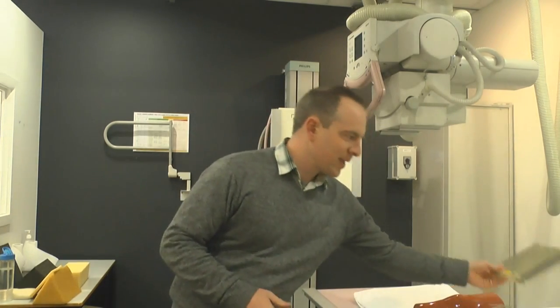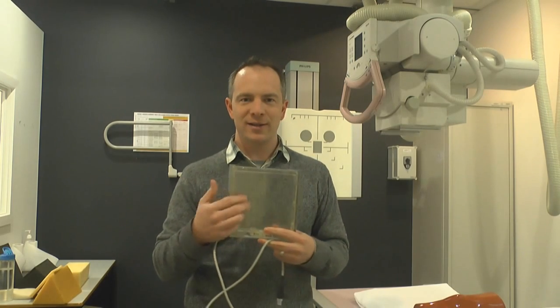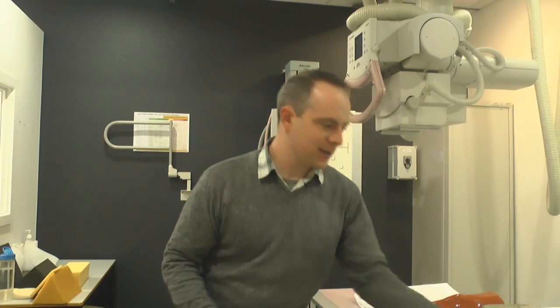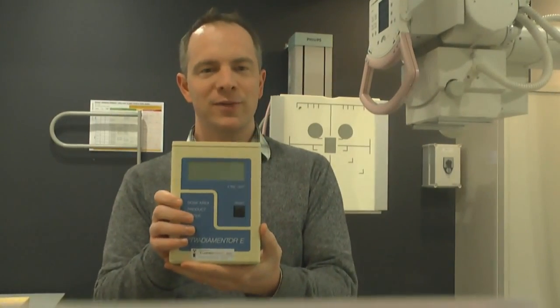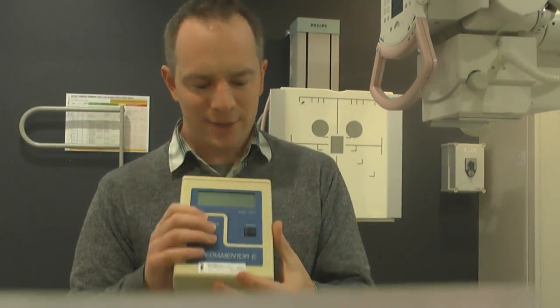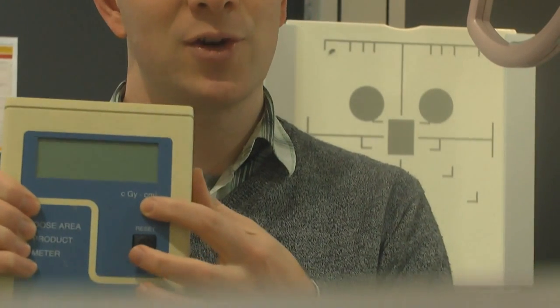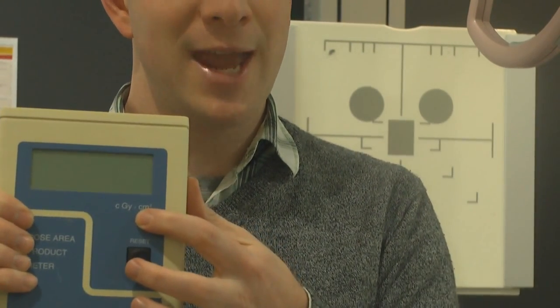So what actually is a DAP meter? Well, DAP, D-A-P, stands for dose area product. So we're actually measuring the product of the dose in joules per kilogram multiplied by the area of the beam inside this ion chamber. So the units are in grays multiplied by units of area. If we have a look at the measuring device, we have a display panel up the top, and that gives us our units. In this case, for this specific instrument, it is in centigray times the area. So that dot is a multiplication symbol, so it's times the area of the beam.